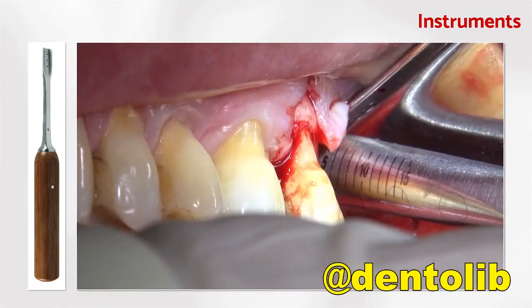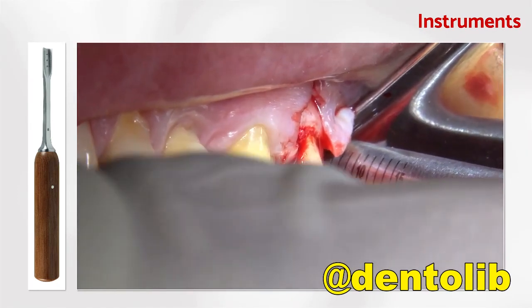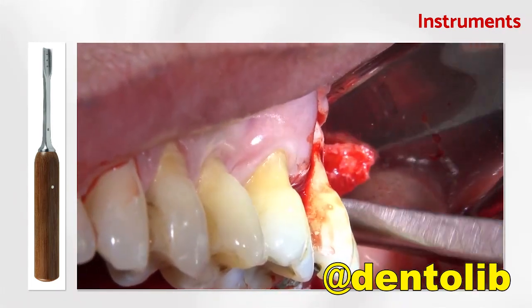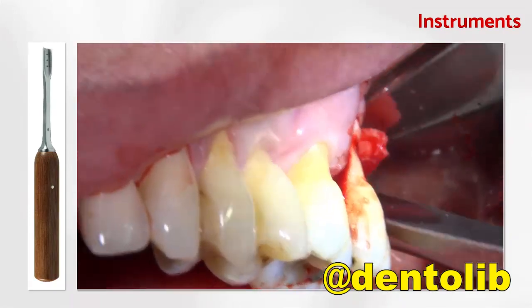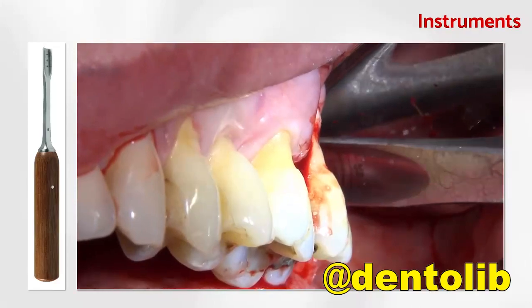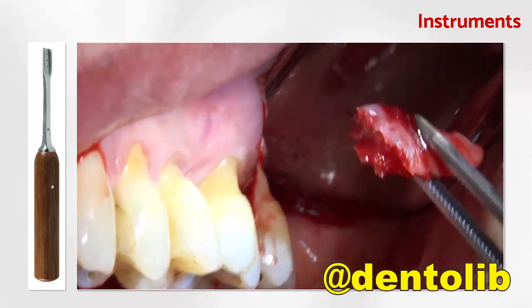The chisel was inserted 2 millimeters behind the second molar. And we introduced these chisels according to the required length. After going to the planned length, the bone was fractured. And here we are releasing the bone from the donor area.